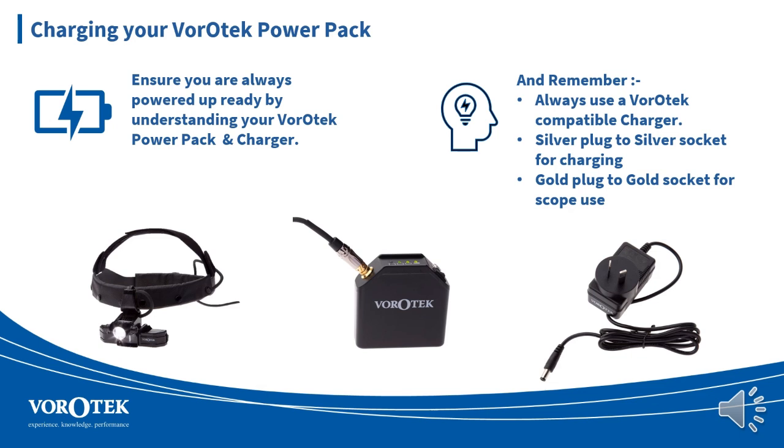The power pack has a secure belt clip to connect it to your clothing and scrubs. Then, to connect and power up your VorOtek O Scope, please plug the gold plug from the scope into the gold socket on the power pack and switch on at the side.